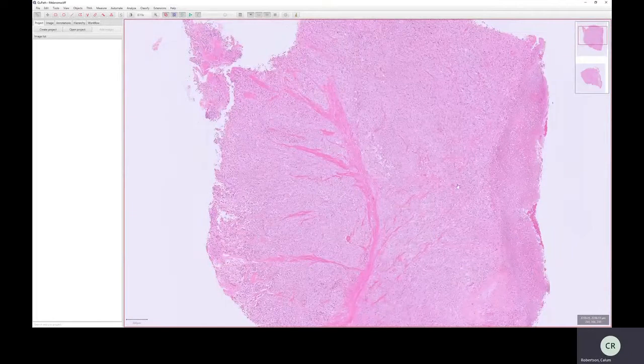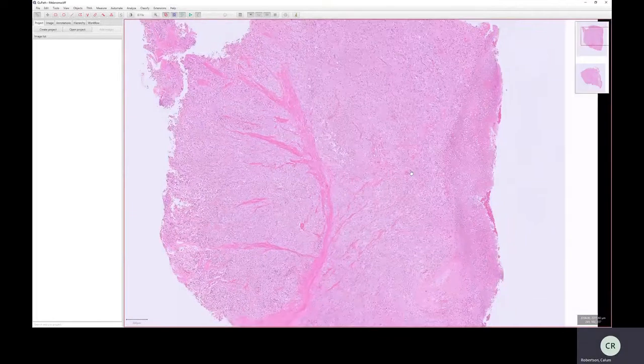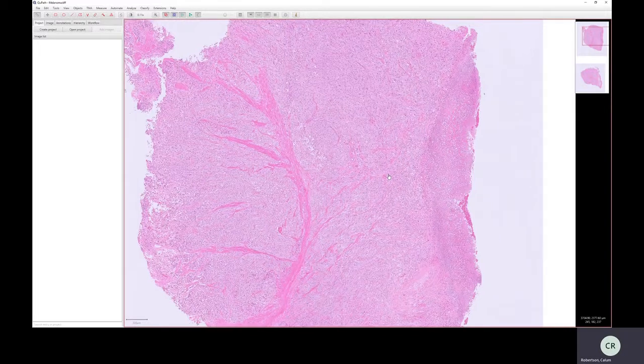So that rounds off this introduction to pathology. Hopefully you got enough out of that so that you can recognize the main cell types, the main tissue types. You can orientate yourself, you know roughly what you're looking at. I suggest you go away and have a wee look at your own slides and try and identify some of these cell types on your own.